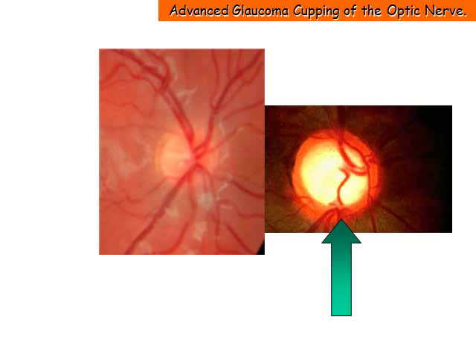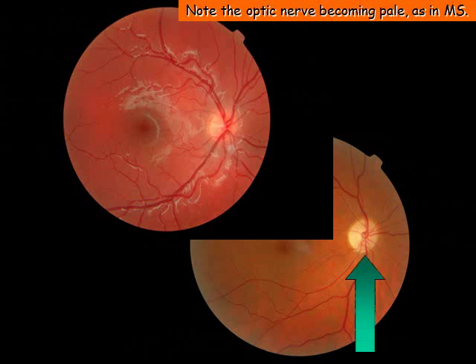This is an extreme example of advanced glaucoma cupping of the optic nerve. Notice the extreme depression and damage due to the weak nerve head relative to the eye pressure. In this imagery, note the optic nerve becoming pale, as in multiple sclerosis.